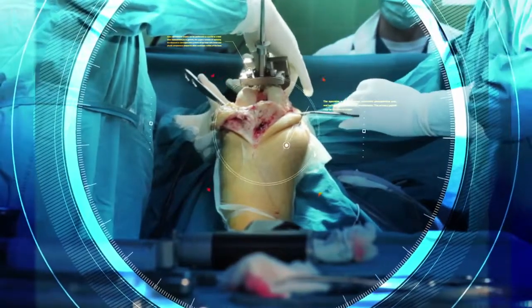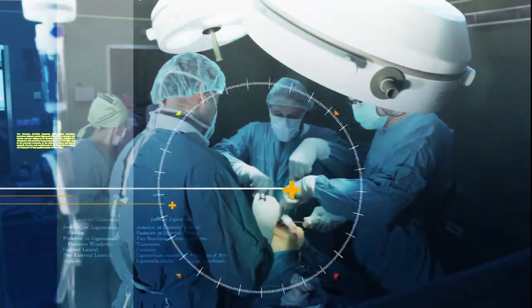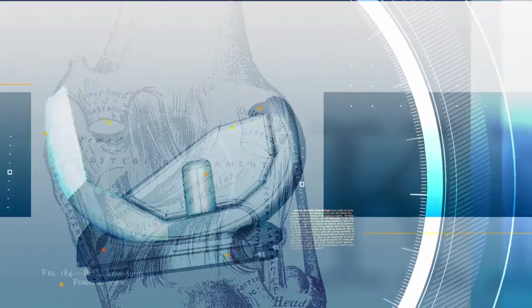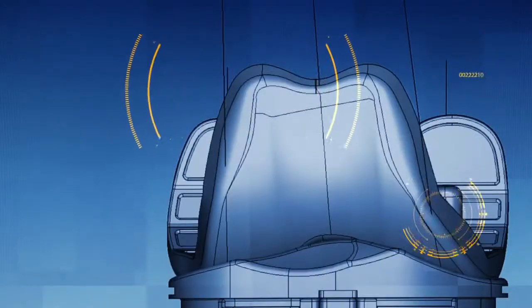We're stuck in what I consider first-generation technology, which to me is symmetrical femoral condyles. And first-generation technology is going to get you, predictably, a B+ knee. It's the roll of the dice. I still have to make you fit that implant. Getting it closer to the anatomy has been the goal of every change since the beginning of arthroplasty.